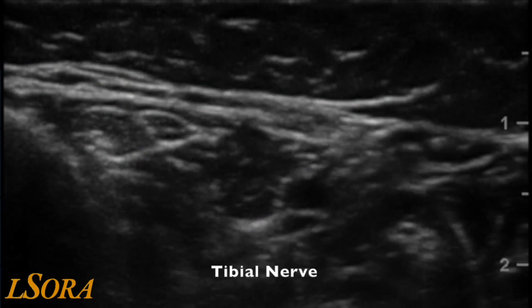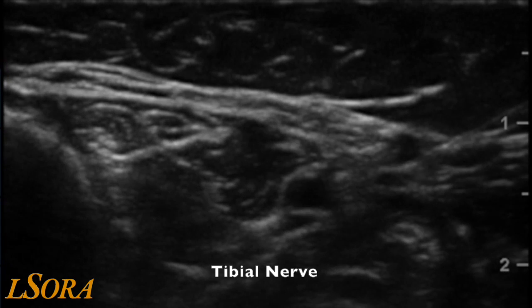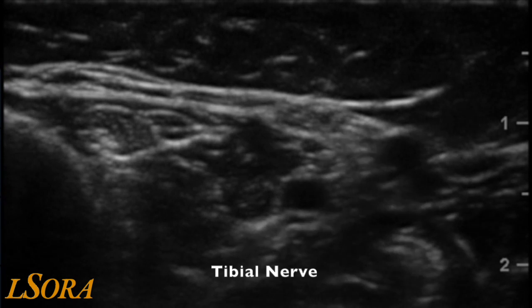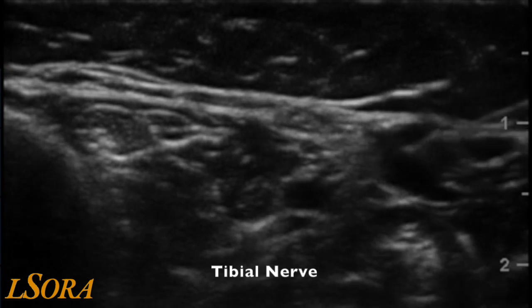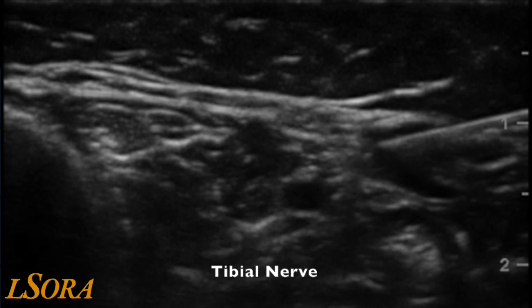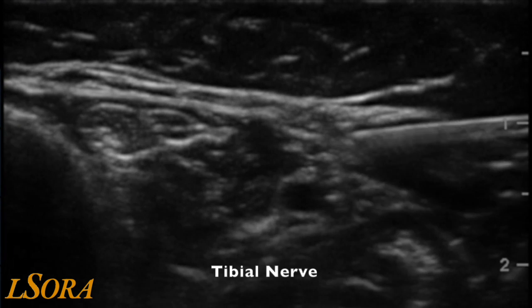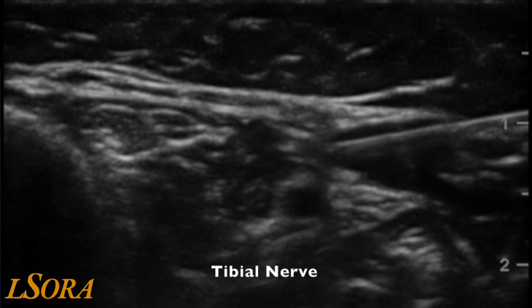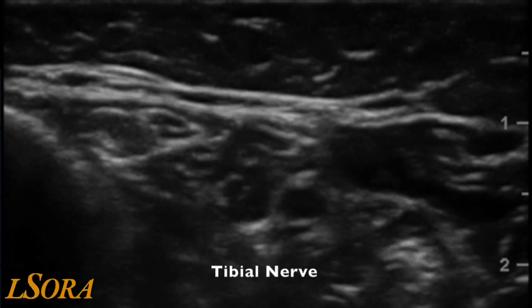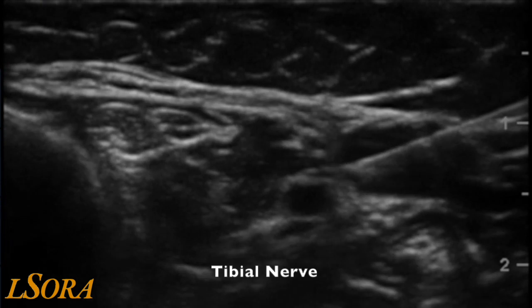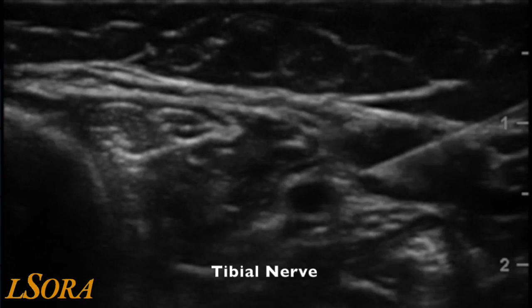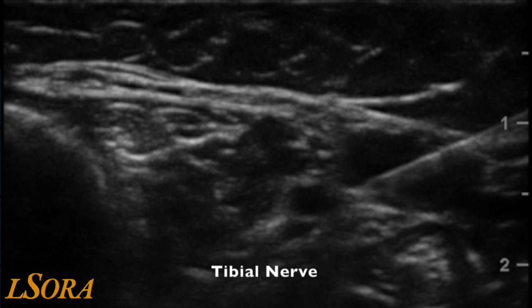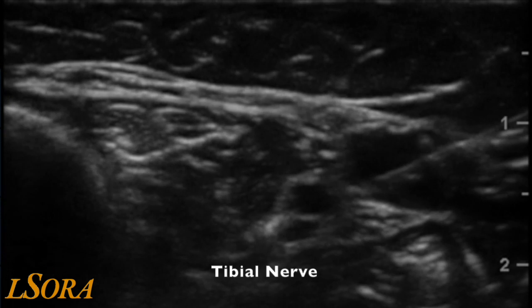In this video of a tibial nerve block, you see the needle introduced from the right-hand side of the screen, or posterior. As the needle is introduced and local anaesthetic is injected, the hyperechoic tibial nerve becomes highlighted. Local anaesthetic is then hydrodissected around the nerve, taking care not to go into the posterior tibial artery or the veins.